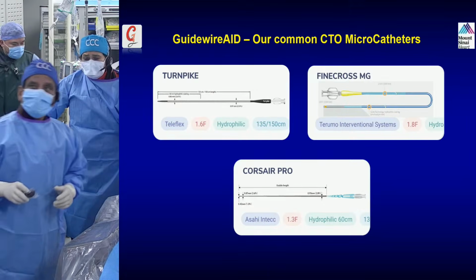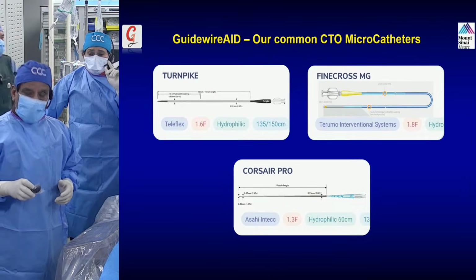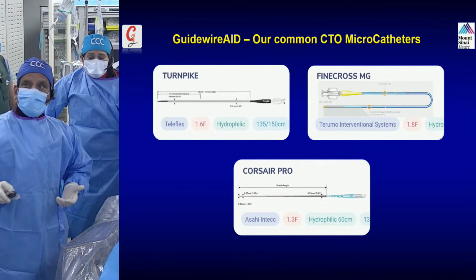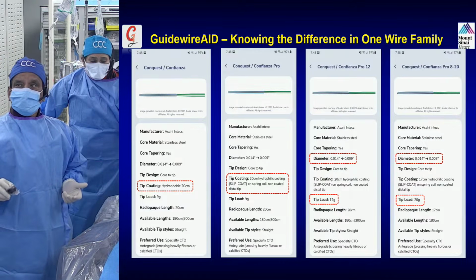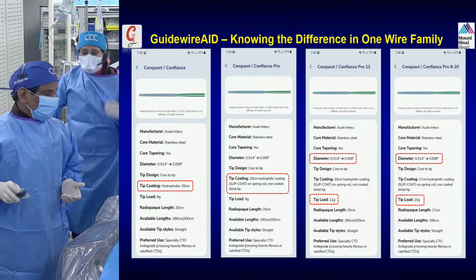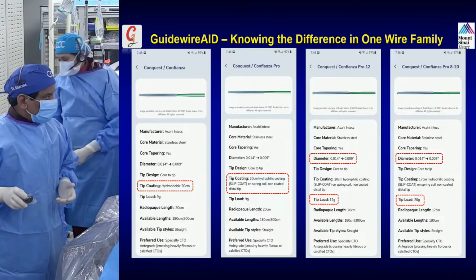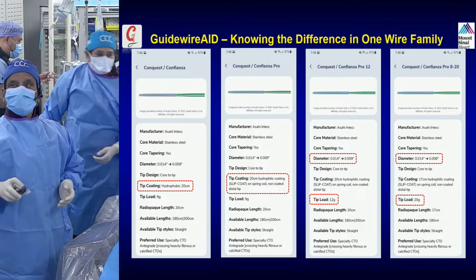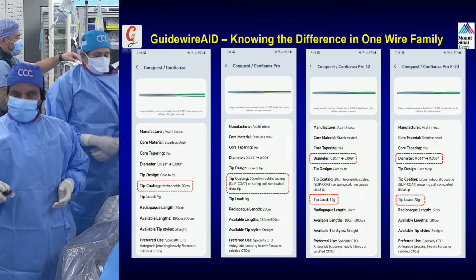So that they know. Like here we have Hornet 14, we have Astato 20-40, and Progress we don't have all of them. We only have Progress 200. They gave 120 and 140, but we don't keep all of them. So that's the way it is. Also it's easier for operators to remember what they have, and for the staff, so they know these wires have to be kept in a particular way, so that when you ask, they can pull it out of the shelf immediately.